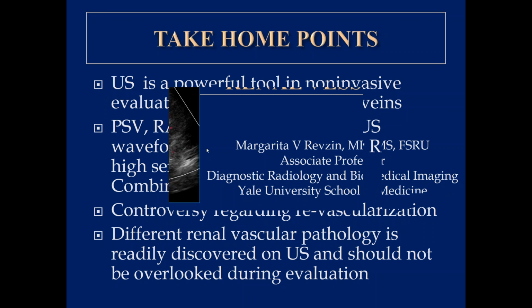Is power Doppler better to detect renal infarct? Yes, I think that power Doppler really amplifies very small velocities that can be found within the renal parenchyma, and therefore even if there is some perfusion present, it will show it, and color Doppler may just show absence of flow.